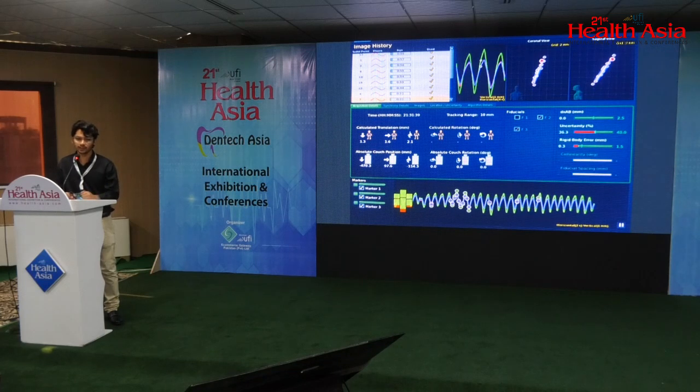This is the phase before we start the patient. This is a verification page which we can use even in between the treatment. If we are uncertain that the patient might be breathing very shallow or very deeply, or might be yawning or coughing, we can go back to the screen and study the whole breathing respiration cycle, and verify at what point we have to take a new X-ray image to make sure that the tumor is within our breathing range.